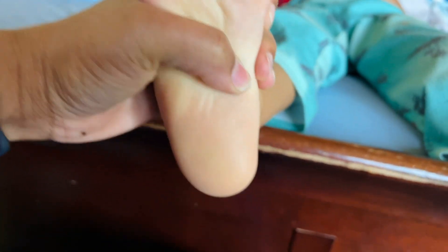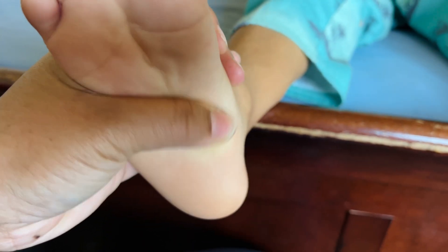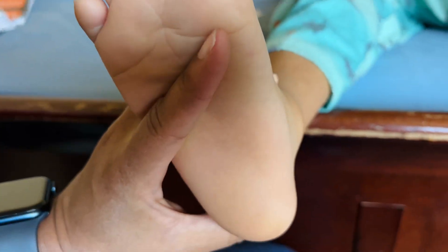The baby's foot is normally held in your non-dominant hand — right-handed people hold the foot with the left hand, and vice versa. Your dominant hand moves the paperwork or microtainer to catch the blood. Always be sure not to squeeze too hard so you're not making the baby uncomfortable or causing any type of pain or damage to the baby's foot or heel.